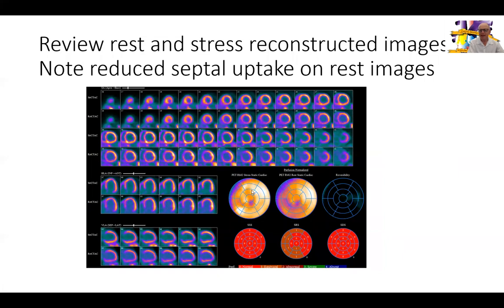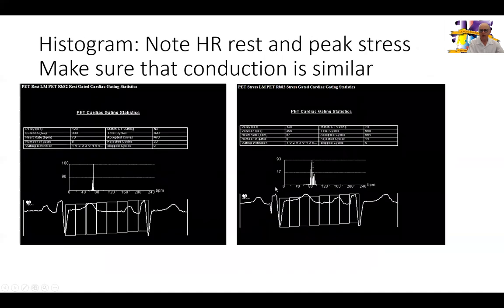Then we go to the 17-segment model. In the rest images you can see mild defects across the inferior wall, inferior septum, anterior septum, peri-basal, and anterior wall. All these defects are almost gone in the stress images. This is what we used to call thallium reverse redistribution, but with PET we do not describe it that way — we describe these images as normal perfusion on stress images.